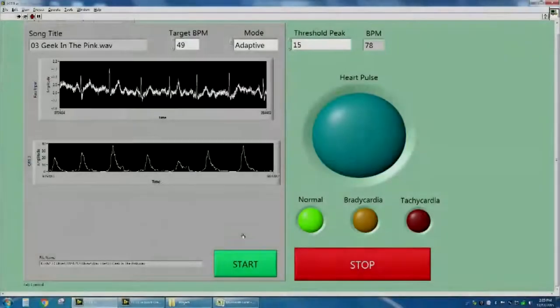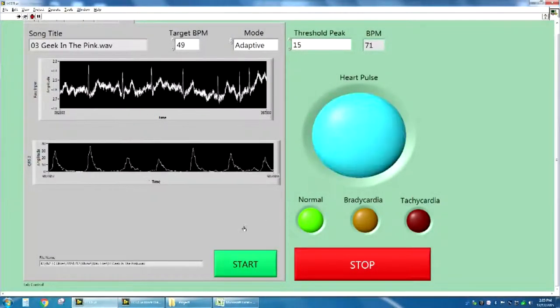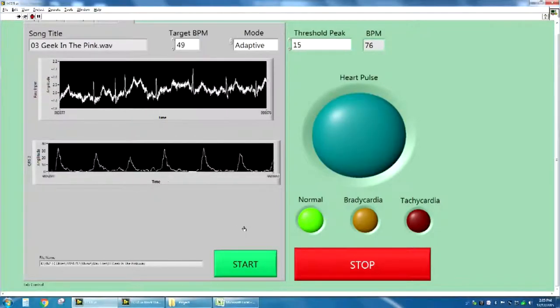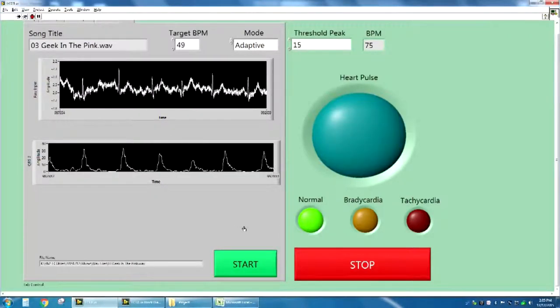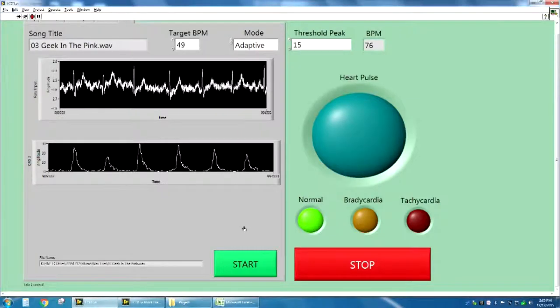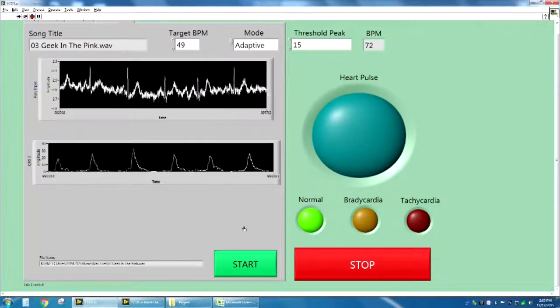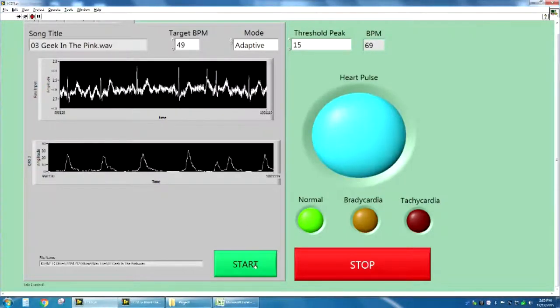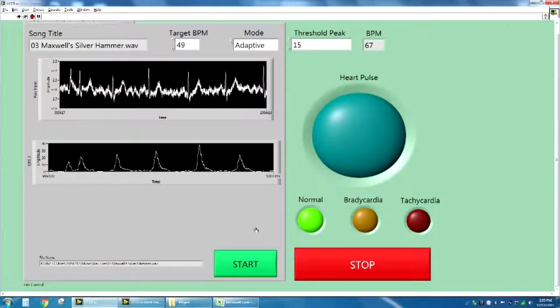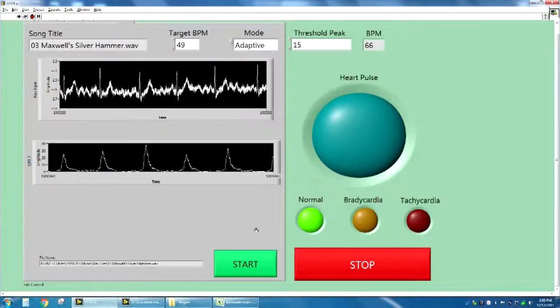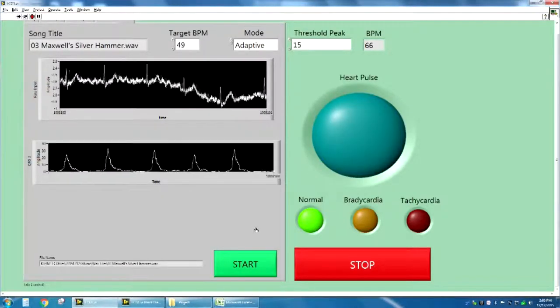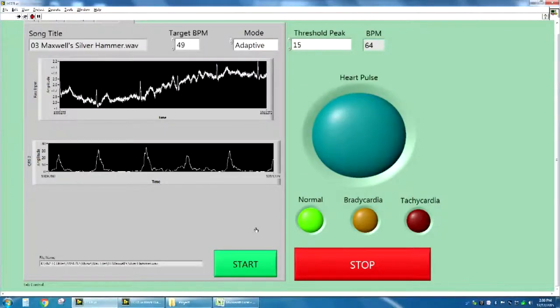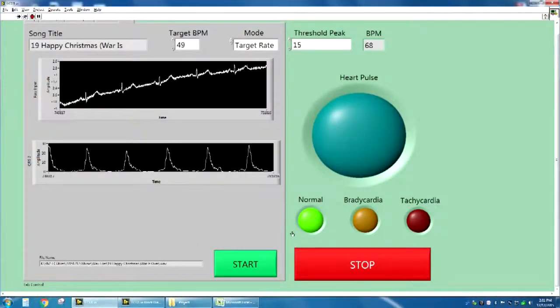Here is an example of the LabVIEW user interface. Here, the music is simulated to show what the user would be listening to. Notice that on the adaptive mode, the song will change according to the bpm. This is an example of the target mode.